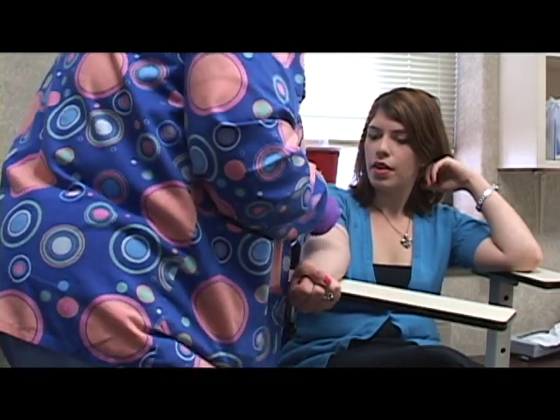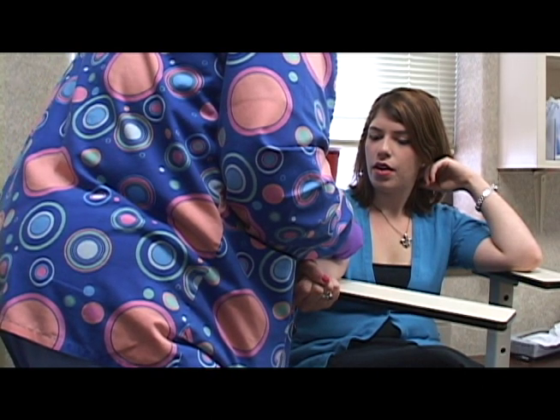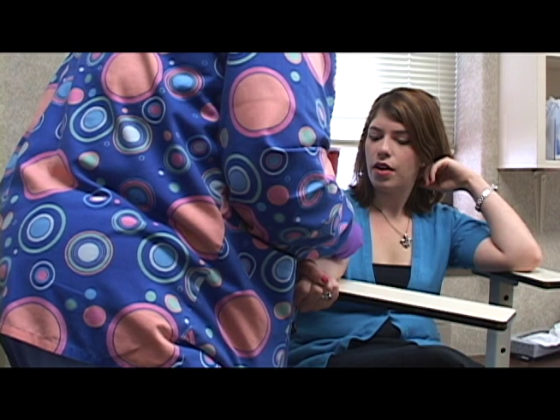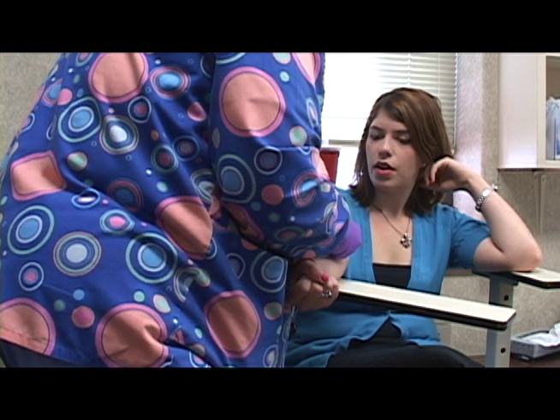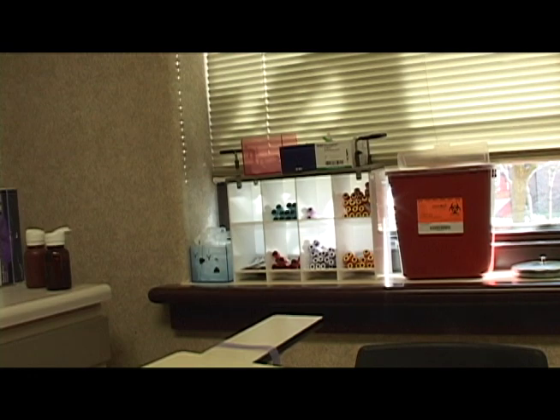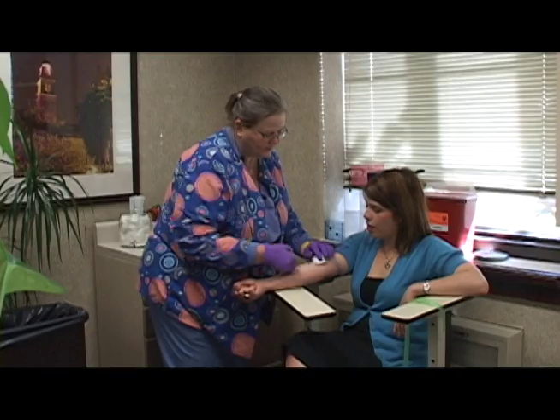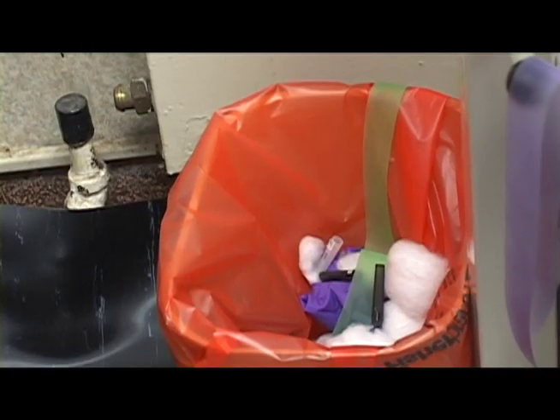I'm going to take the needle. We're going to go into the vein, take the tube, put it on, draw the blood, and we're done. Not that bad.